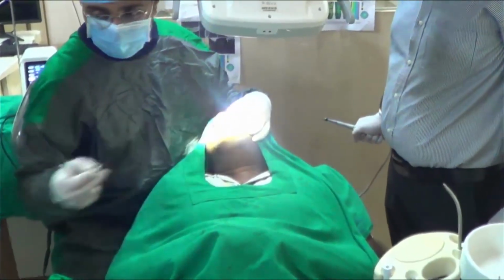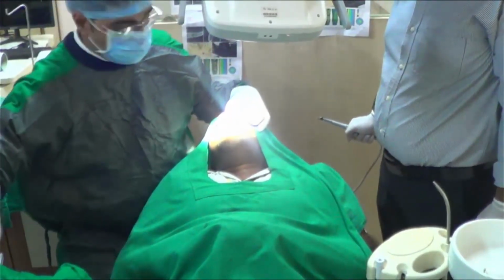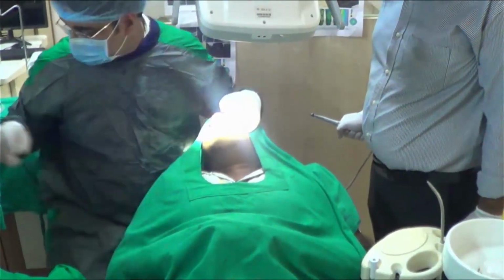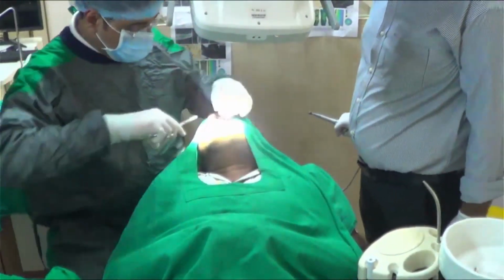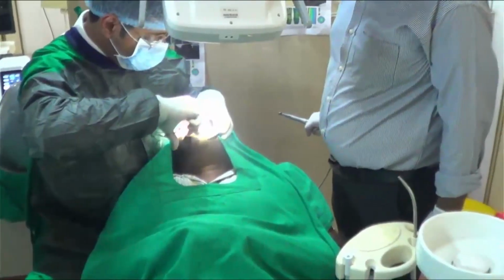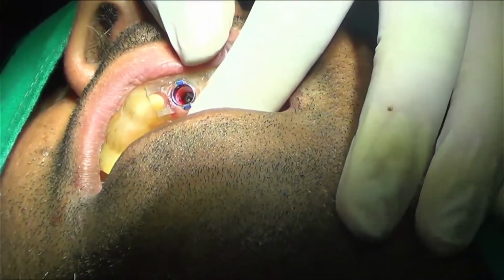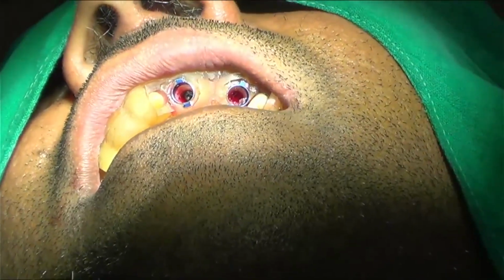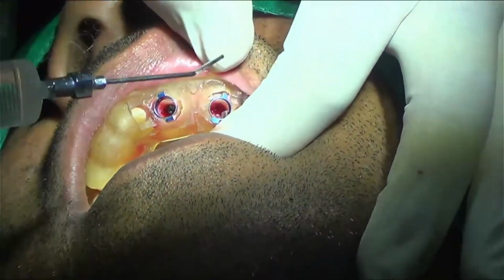Now you remove the components. Now we will put the second implant. Now it has been some time, so I want to irrigate the site.